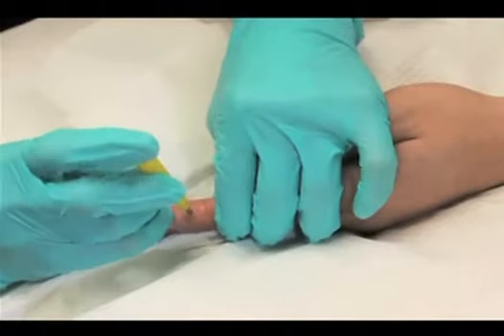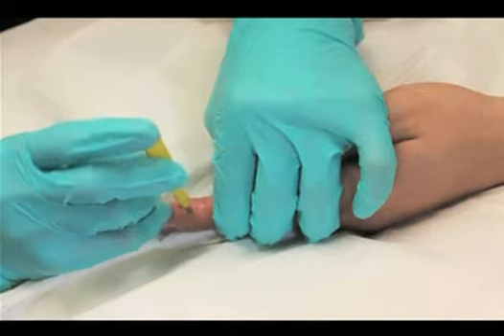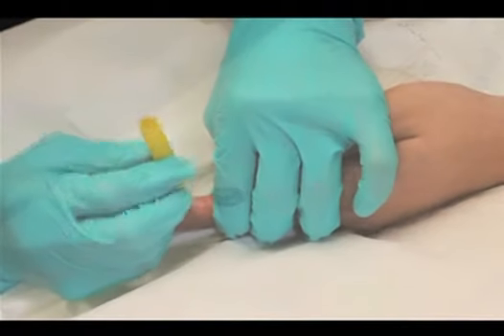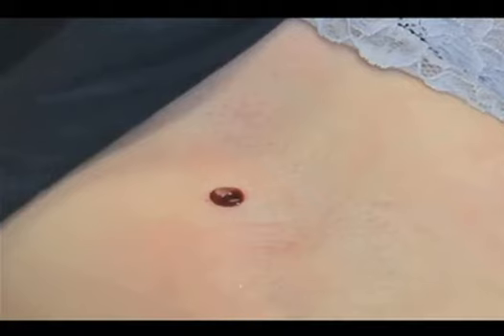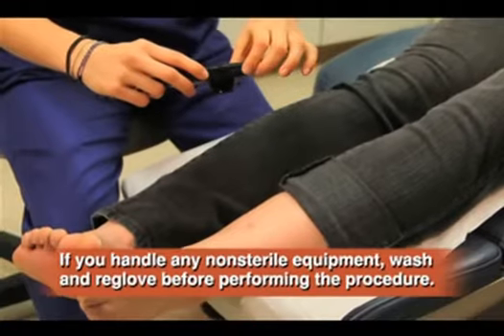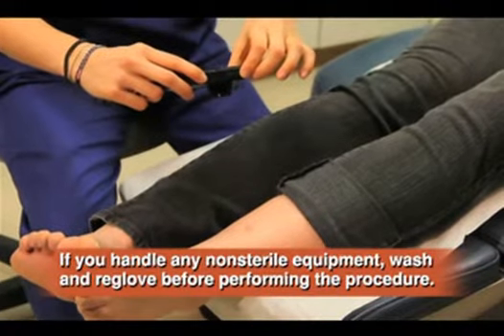Plunging a biopsy punch into the temple, a finger, or the jaw may result in substantial injury to a nerve or artery. It is also possible to lose a biopsy site once it heals, as the lesion may no longer be visible, which may be problematic if further treatment is indicated. Taking a photograph of the marked biopsy site with the patient's consent is recommended.